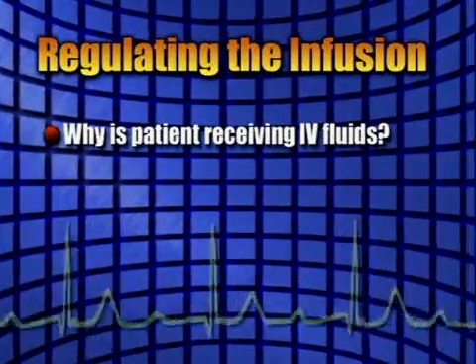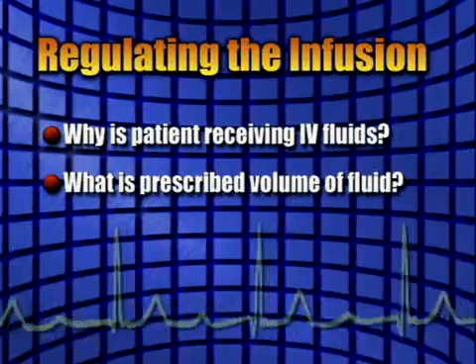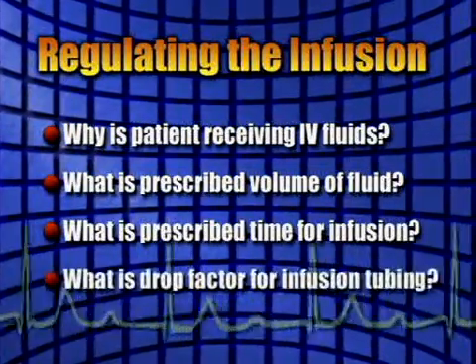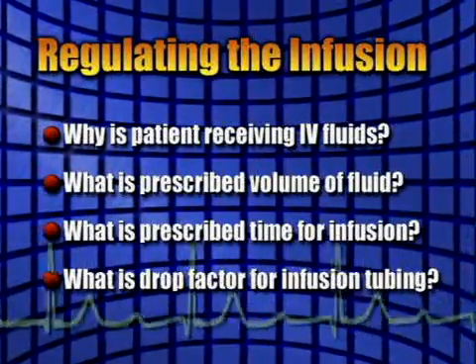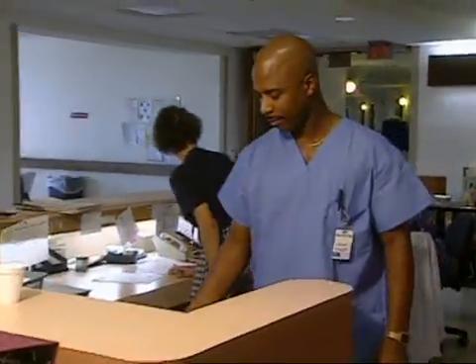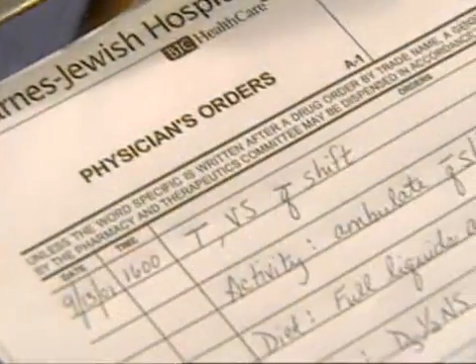Why is the patient receiving intravenous fluids? What is the prescribed volume of fluid to be infused, the prescribed time for the infusion, and what is the drop factor for the type of infusion tubing being used? Always read the physician's order carefully and ask questions if you are uncertain about any element of prescribed therapy.